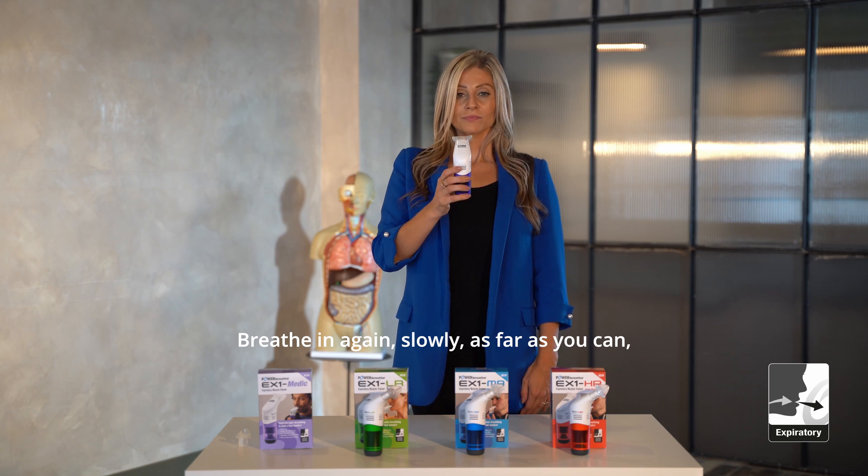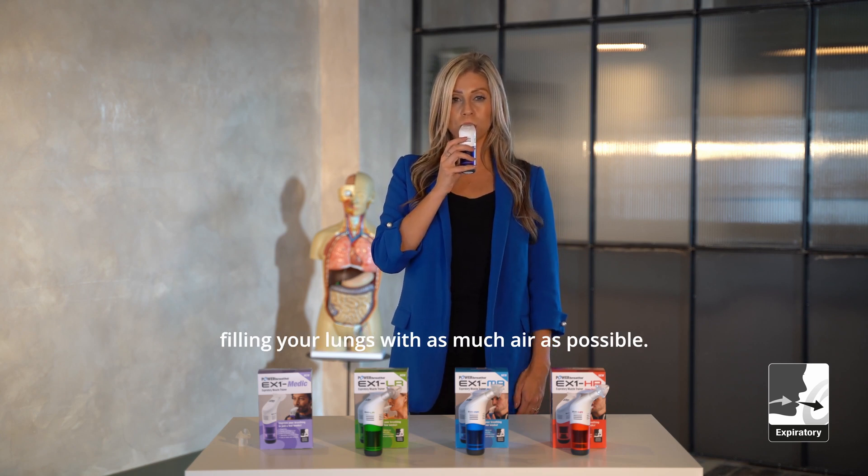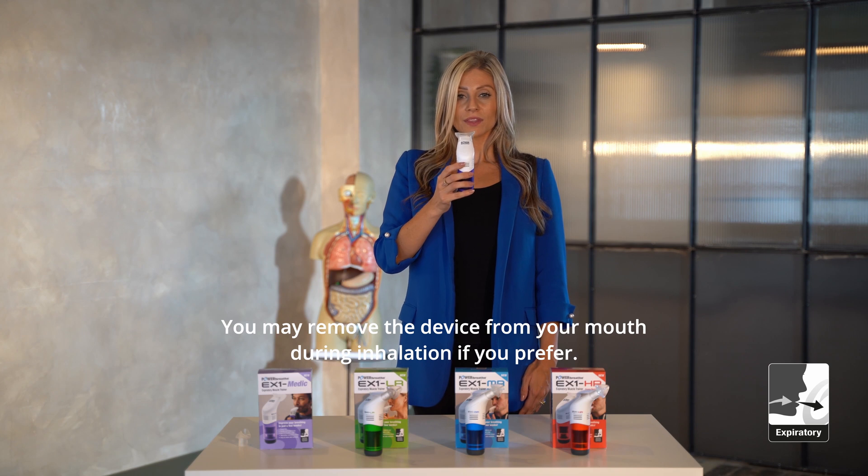Breathe in again, slowly, as far as you can, filling your lungs with as much air as possible. You may remove the device from your mouth during inhalation if you prefer.